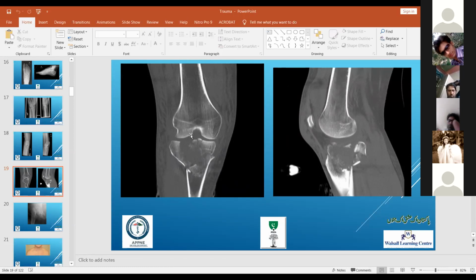Okay, so this needs an Ilizarov frame. This is a very complicated fracture. I don't think you'll be able to fix this, put plates on it and whatever. What's a bone metal sandwich? This is another thing that people talk about in the exams in this country. What's a bone metal sandwich?